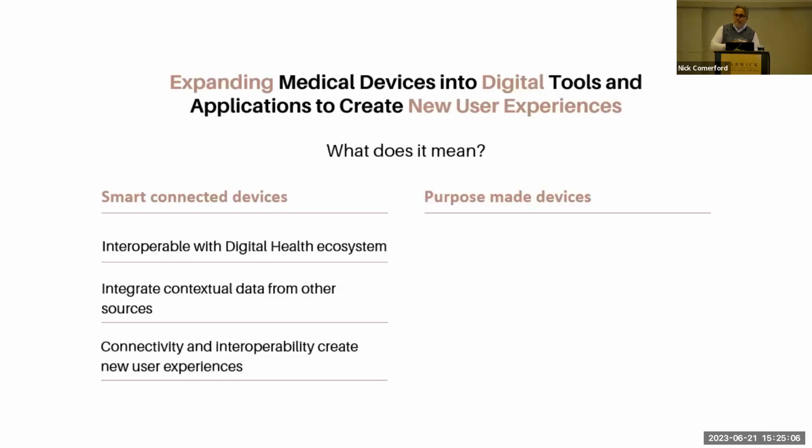There are always a lot of use cases for data, and that's never a bad thing. So the way that's typically done, you add some connectivity to your device, you get data from your device, you build an app, you connect to the EHR. You have maybe some app that you gave to the patient because the patient likes to monitor their care.